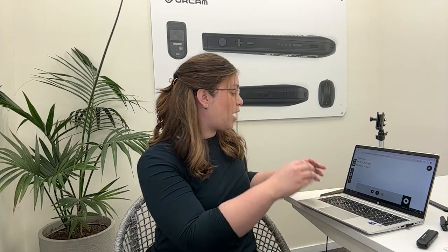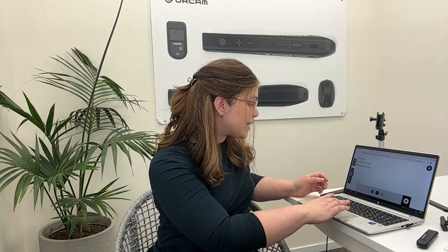There's so much this can do. It can read the full text, it can summarize, I can zoom in, and I can change it to many different contrast levels. If you can see here, I don't know how well you all can see, you can choose all different colors to make it easy for you, if you'd like to access the text on your own and you have the level of vision to do so. You can do that so easily.